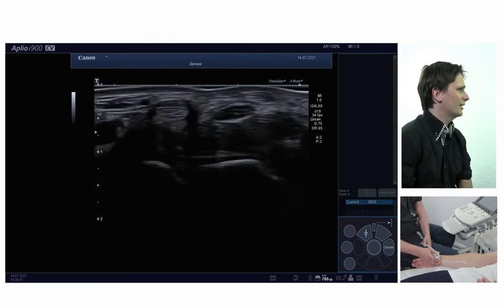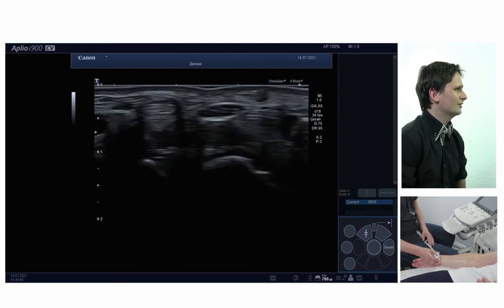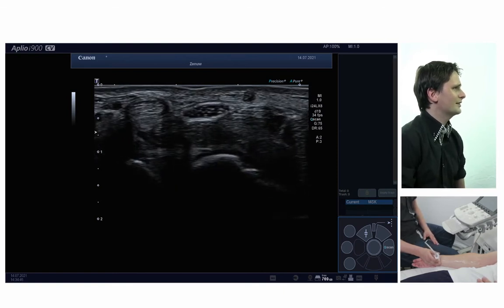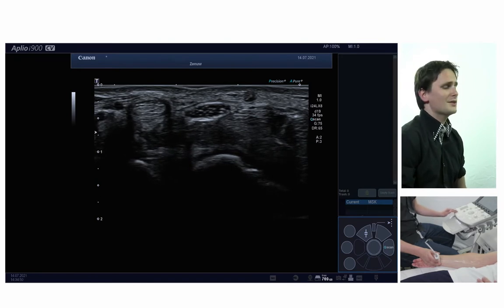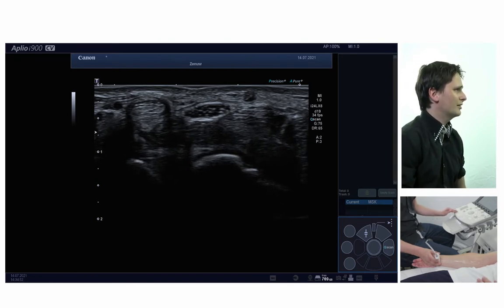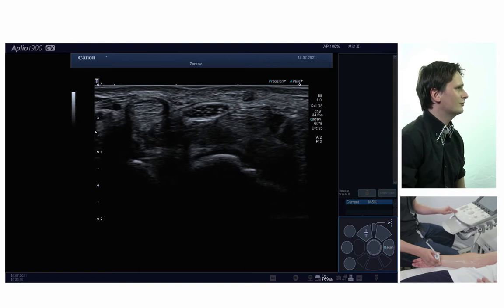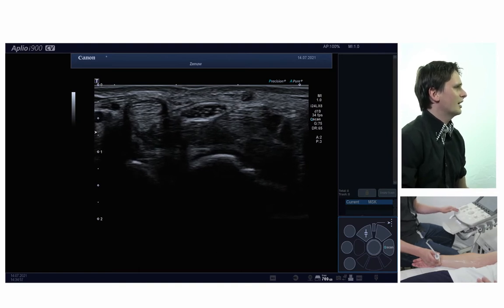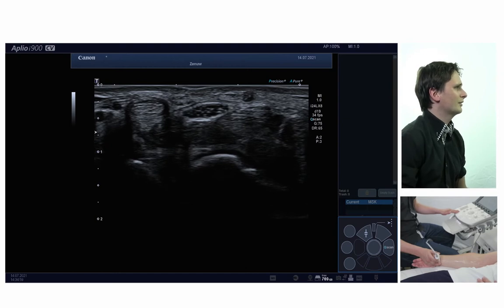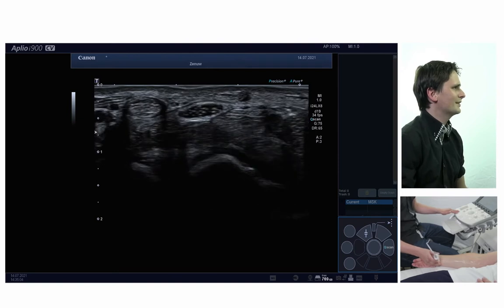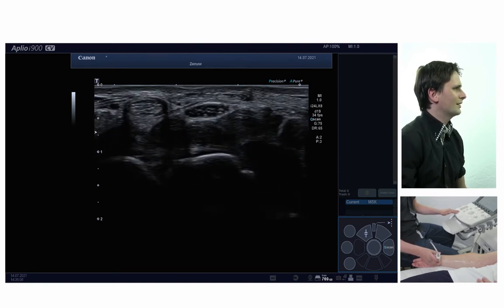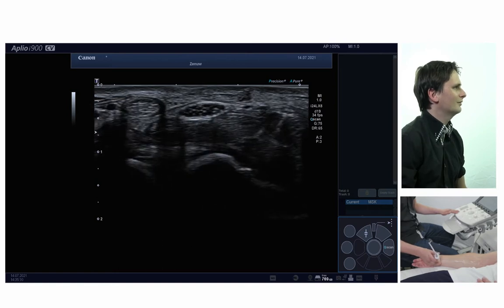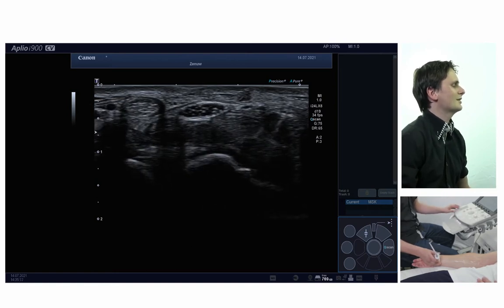To start the scan, I'll look for the nerve at the carpal tunnel, just proximal to it. Here you can see it very nicely in the middle of the screen — a nice honeycomb structure. If you doubt whether you have visualized the nerve or tendons, you may tilt the probe a bit. As you can see, the tendons will get dark very easily while the nerve keeps its honeycomb structure.